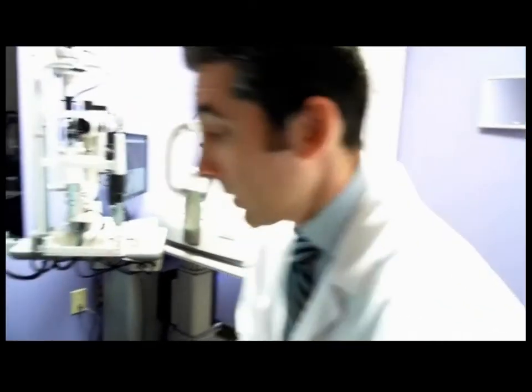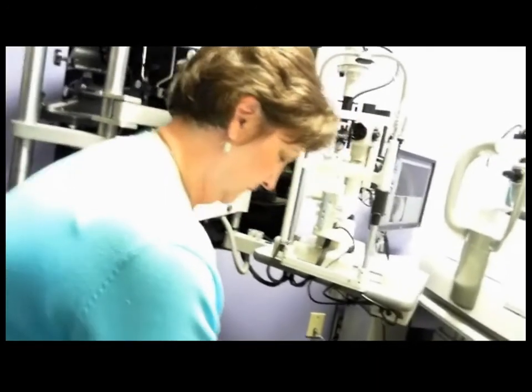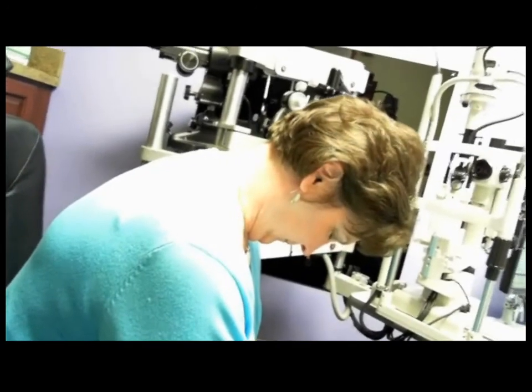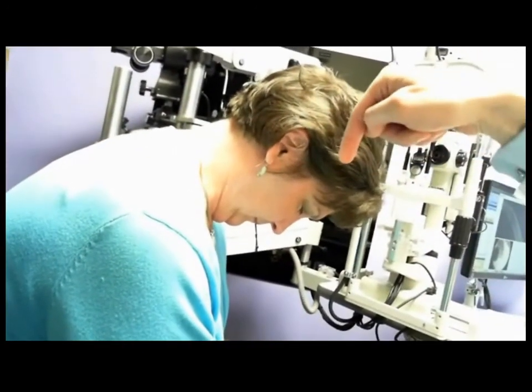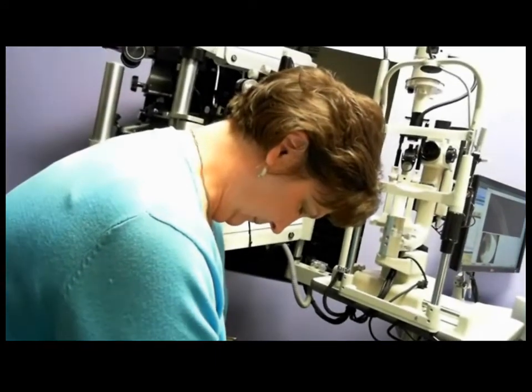So we're ready to insert lenses. And one of the most important factors in your success in getting a lens on a patient is the patient's body posture. Having the correct posture will ensure that you have a good target to put that lens onto. And so what we're going to do is have Darlene lean forward with her elbows on her knees. That's it. And we're going to have her tuck her chin into her chest. That's it. And now you can see that her cornea is staring straight at the ground. And by doing that, you will have that good target to put the lens onto.